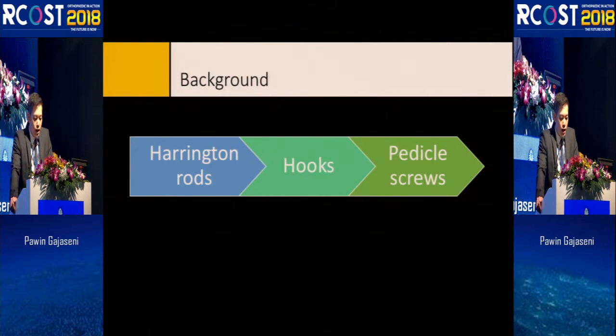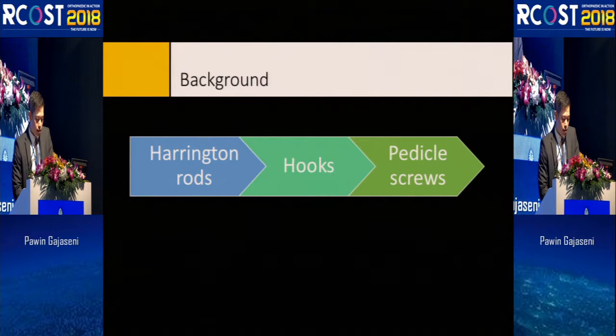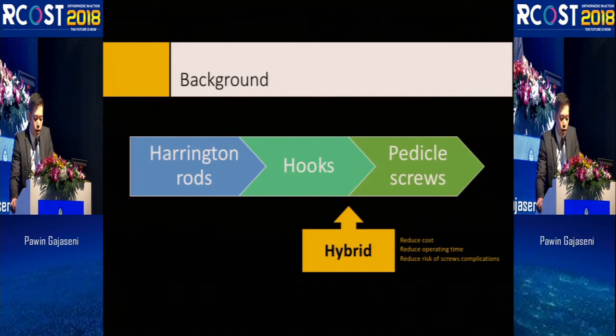After the era of the Harrington instrumentation, the hook instrumentation system became the gold standard for AIS treatment. But over the last 2 decades, pedicle screw systems have replaced hook constructs. Pedicle screws can be used alone or in combination with hooks, often referred to as the hybrid, which can reduce the cost, operating time, and the risk of screw complications. As Ajahn Arisak said, the rate of misplaced screws may be higher, around 8 to 10%, especially at the thoracic level.